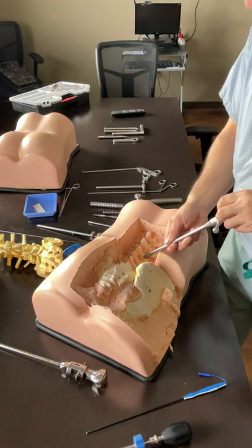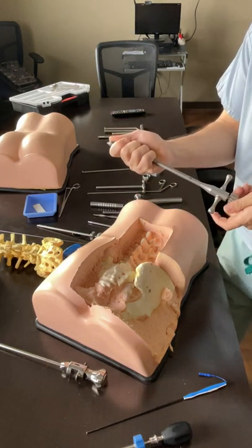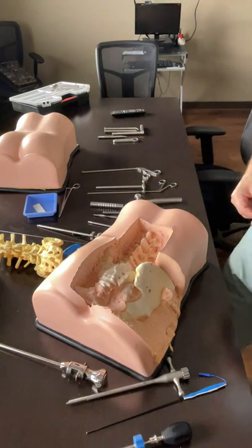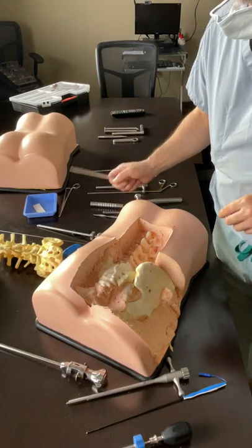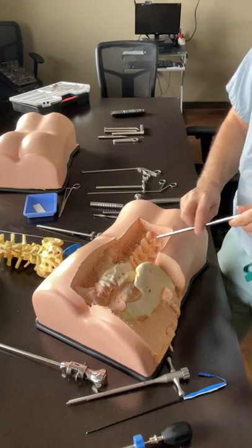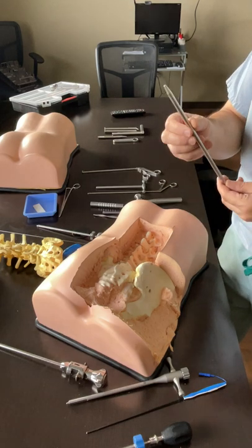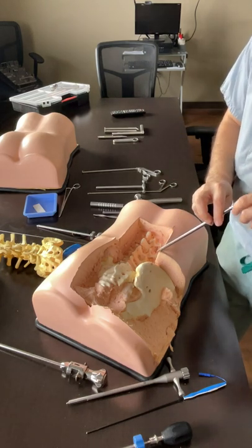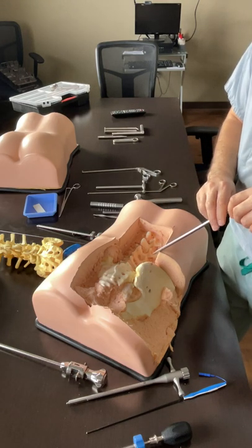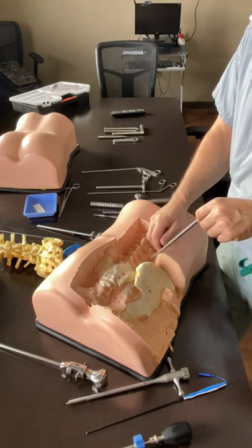Once the cage is in, you disconnect and take the inserter out. If there is a need to go back in and reattach, there is a hole in the skin and a path memory. If you need to go back in, take the dilator and just let gravity do the work. If you push it, you create a new path, but if you let gravity find its way, it finds its way through the tissue and finds the cage surprisingly well.